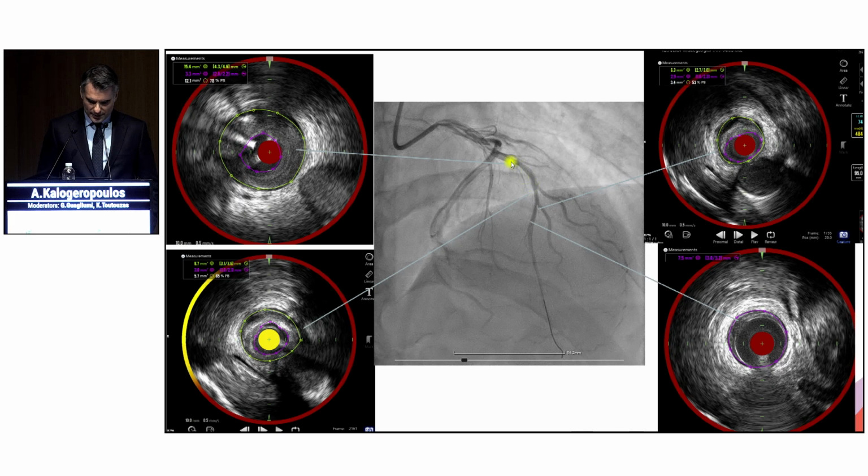And then in the more proximal segment, just after the septal branch, we can see there's a huge fibrous plaque with plaque burden 78% and a minimum luminal area of 3.3. I'm sorry I haven't shown you the ostium LAD, but I can tell you the minimum luminal area is around 7.5. So based upon the lumen, nothing to be done proximally, but exactly, to be taken into care for the future.